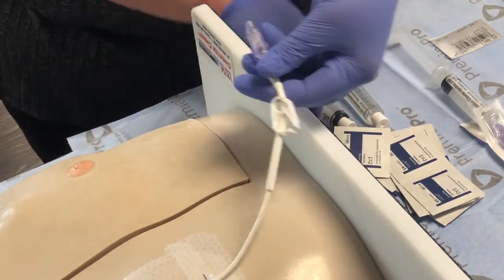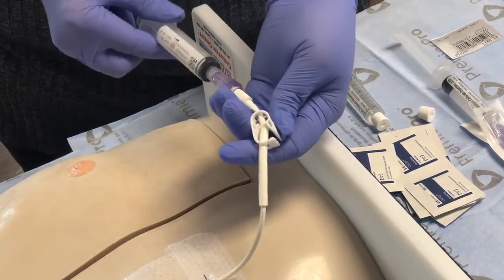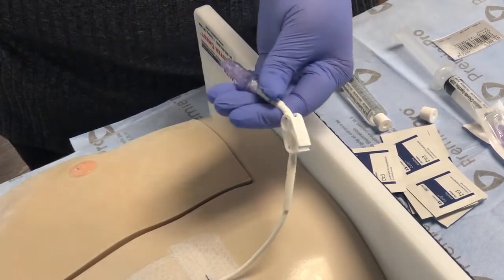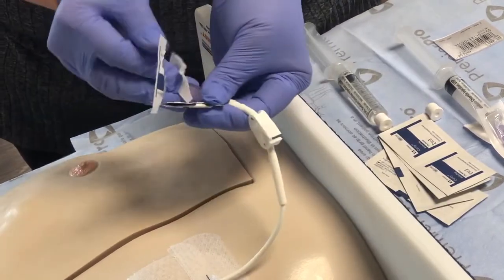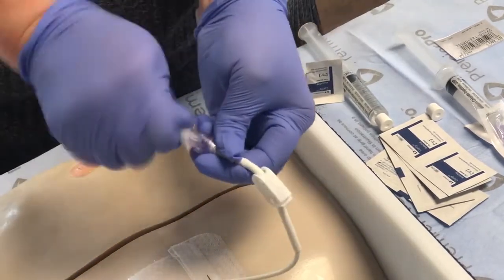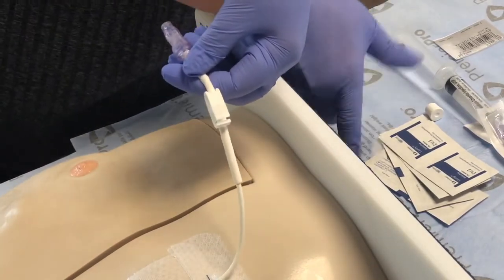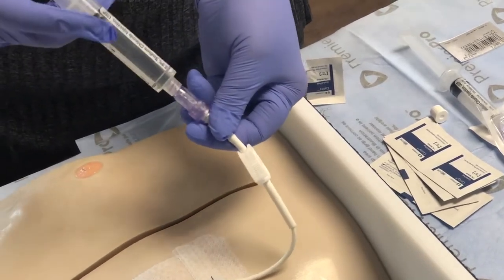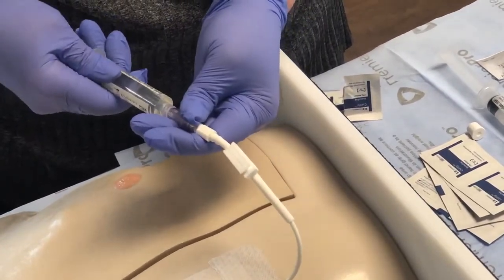Attach an empty 10 ml syringe for your laboratory sample. Gently aspirate the desired amount for your specimen. Remove, scrub the hub, and allow to dry for 60 seconds. Attach a saline flush and use the pulsatile method to flush. Clamp the line and remove the existing hub.